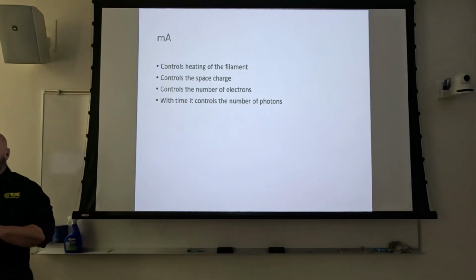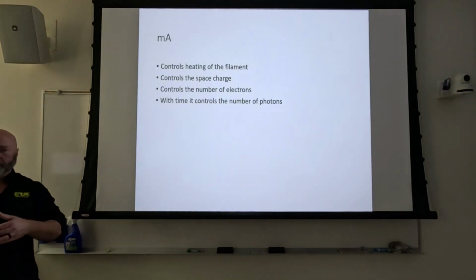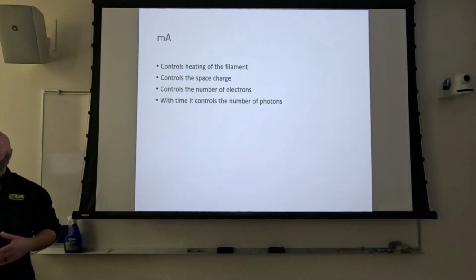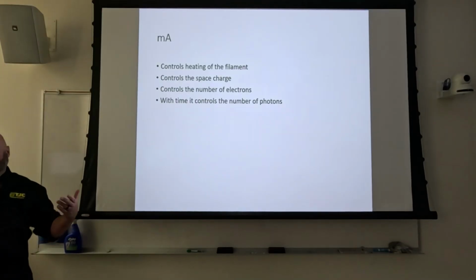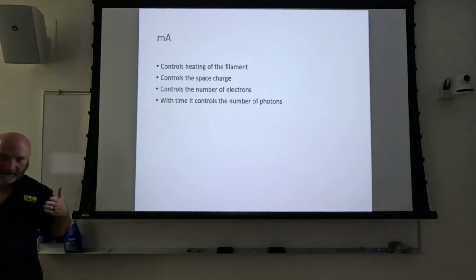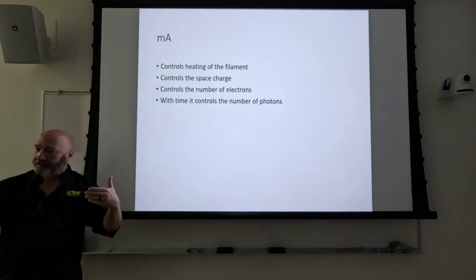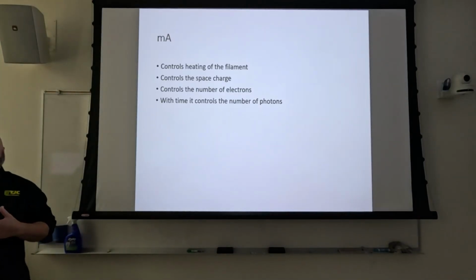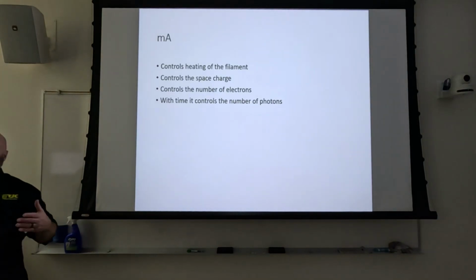What controls your space charge? And the stream of electrons go across, keeps them compressed. The cup, focusing cup, exactly. It's a focusing cup. So it's got a negative charge, it's like 25 kVp or something like that. Keep them compressed so that they at least leave the filament, you know, packed together like a bag of leaves. Once they escape the focusing cup, they're going to spread out a little bit, but the purpose for the focusing cup is to keep them somewhat compressed.